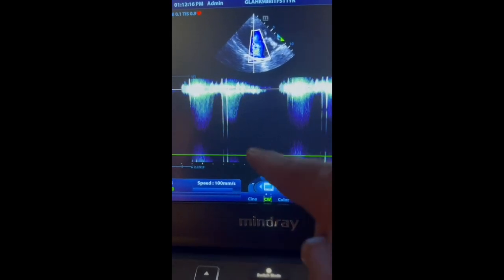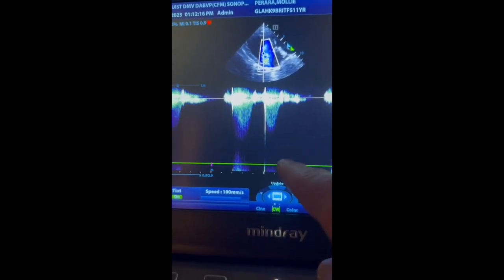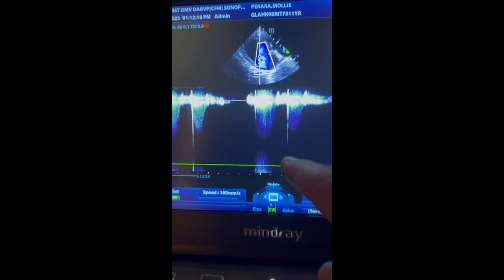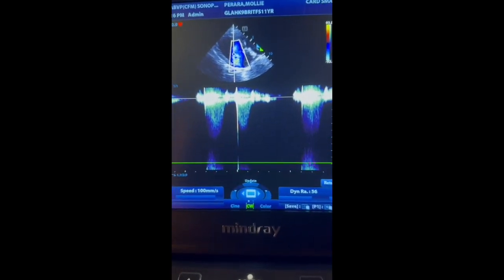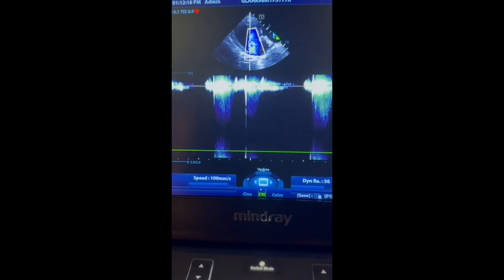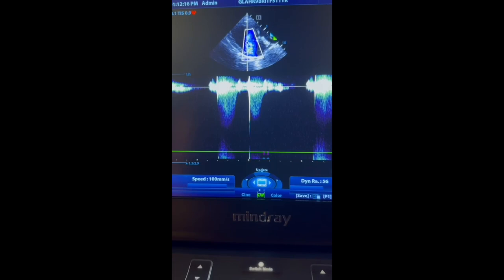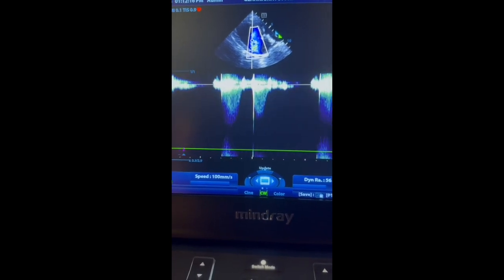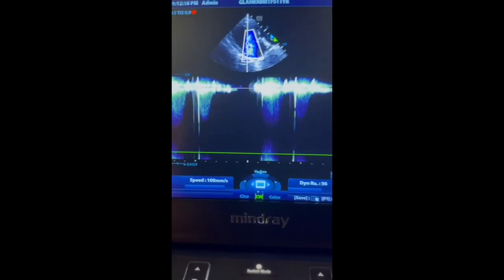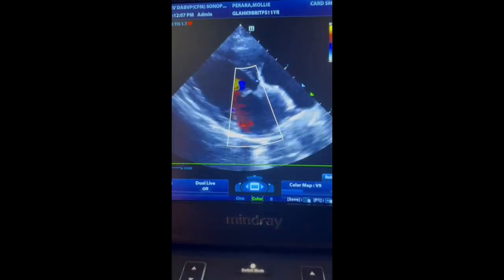And then my spectral Doppler is clean, and you see the abnormal rhythm going on, but you see nice envelopes on the spectral Doppler at 10, 12 centimeters. That's what you want. That's an acoustic power thing along with software, along with correct frequency, and the frequency I'm at is 3.5 megahertz on this. So these are things to test regarding resolution depth and the Doppler assessment.